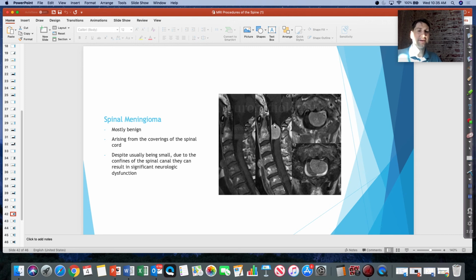So you can see here how this could cause the patient to be completely paralyzed just because it's impinging upon this C-spine, spinal cord, pretty high up, almost near the brainstem. But it is a very round tumor, meaning it is benign, but the only danger here is what it's impinging upon. So if it's very small, they could just monitor it over the years.